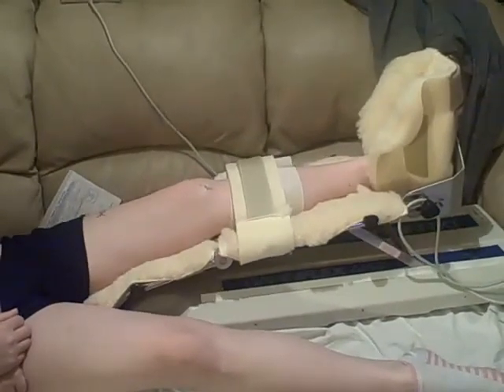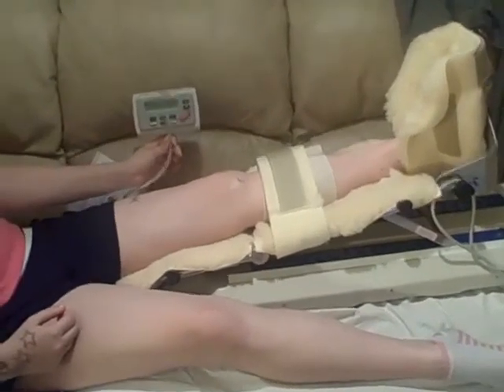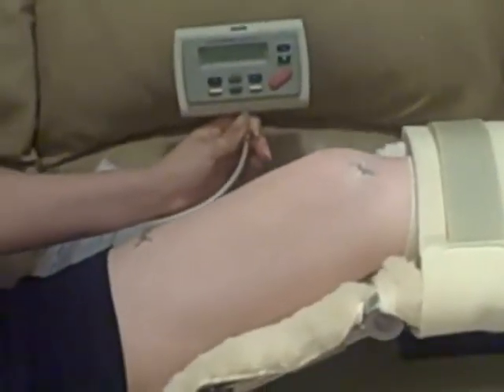The patient does have control with a switch so that if it becomes intensely painful they're able to stop it, and the patient is able to control the amount of range of motion, making it higher or lower.